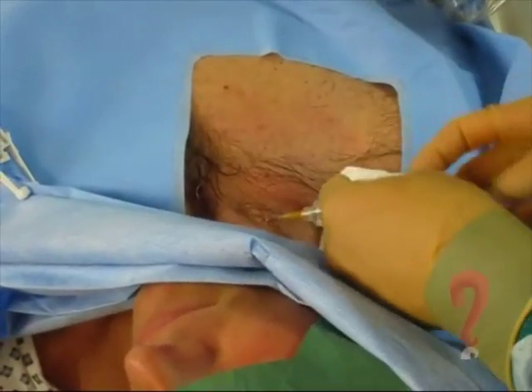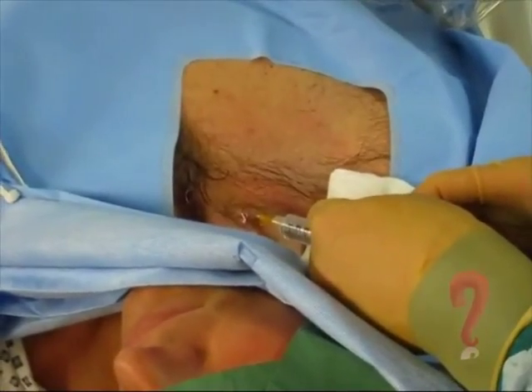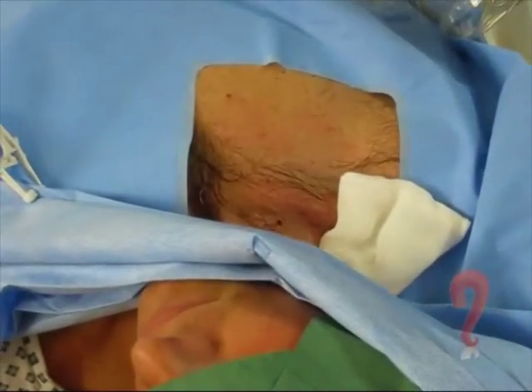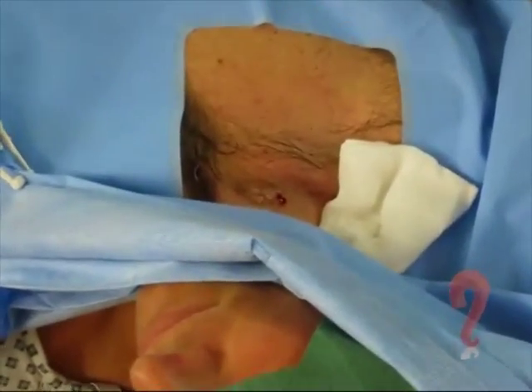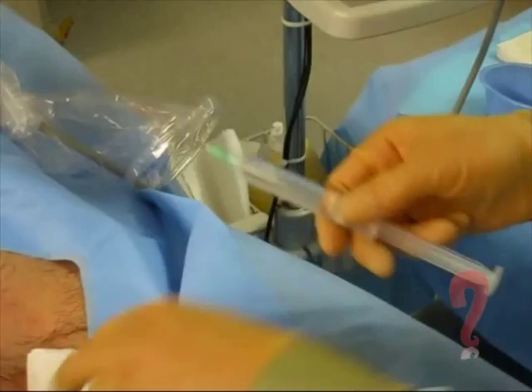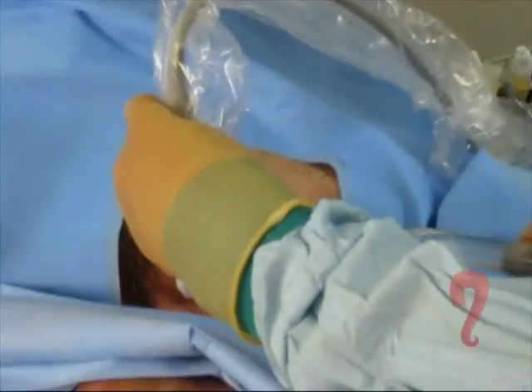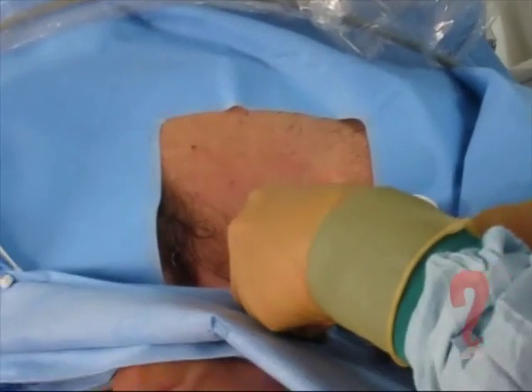This will sting, I'm afraid, starting with the orange needle. I'll then bend the green needle so I can get a better angle over the clavicle. I'll put the local anaesthetic in with ultrasound guidance — sharp scratch again, a bit more anaesthetic — so that I can see exactly that I'm anaesthetising the track that we're going to use.